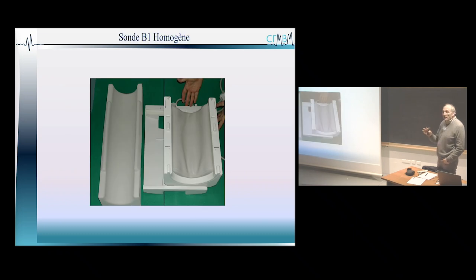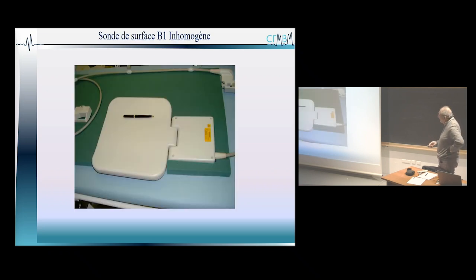Okay, so the coils, what are they looking like? The coil will be actually adapted to the organs you want to scan. I'm mainly showing coils for muscle because I'm doing muscle investigations. But of course, you've got coils for all the parts of the body: a coil for the wrist, a coil for the knee, a coil for the head. And each time they will be specific, to optimize the magnetic field within the region of interest, and also to optimize the reception of the signal.